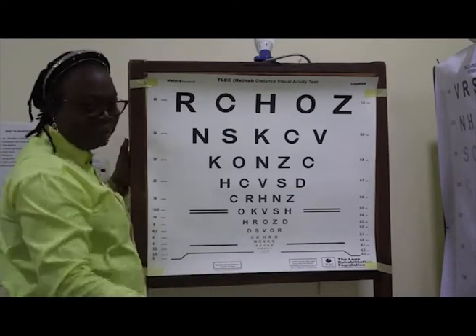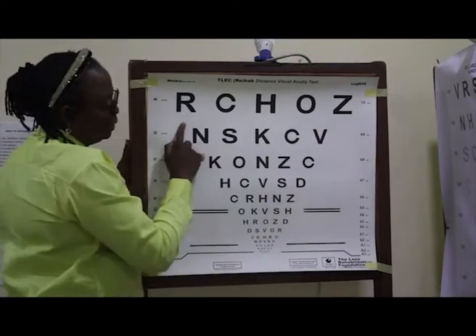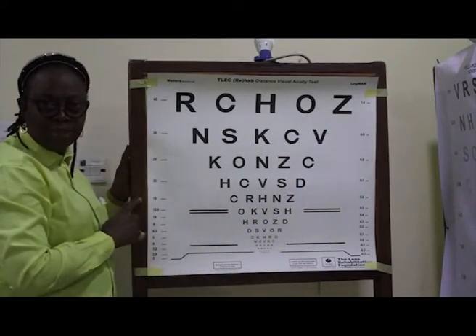So assuming your patient sits at 4 meters away and is able to read this entire line, then you say the visual acuity is 1.0 LOGMAR.